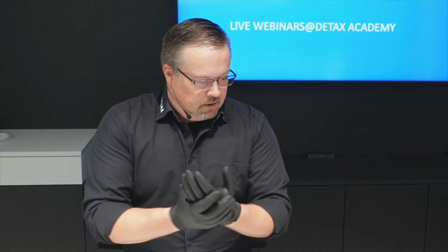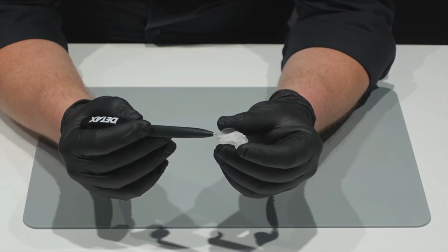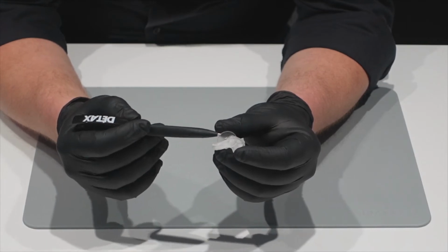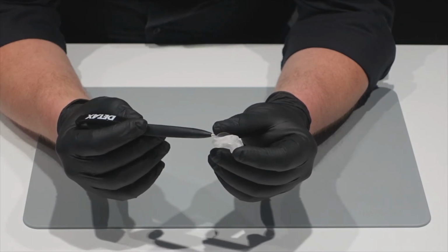So here's our working place. I need some gloves for filling the casts. We talked before about the spheres, the small cylinders here on the surface, which also go inside of the object, to make sure that the rest of the air inside of the cast form, when you fill it up, is possible to come out of these small hollow cylinders.